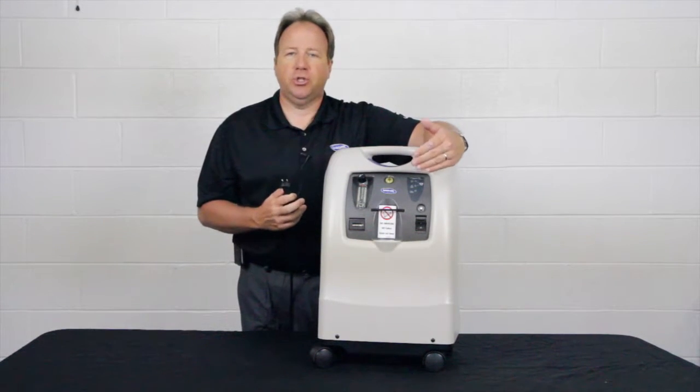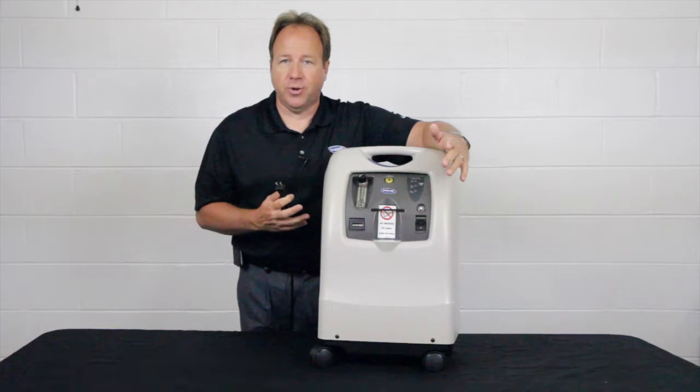And those would be the quick troubleshooting steps you would do to make sure you're getting your concentrator running.